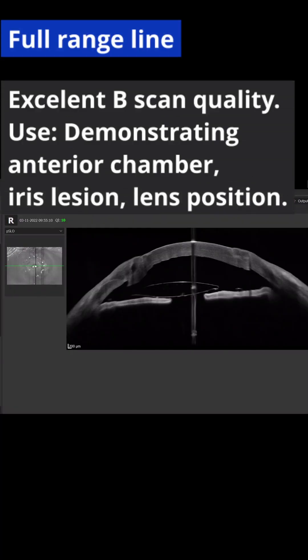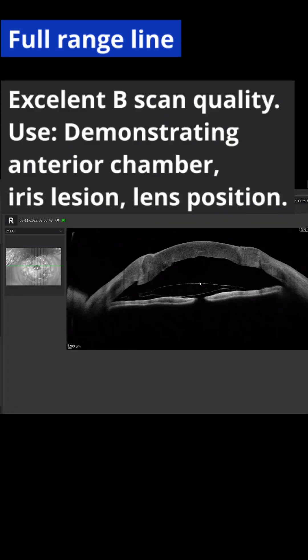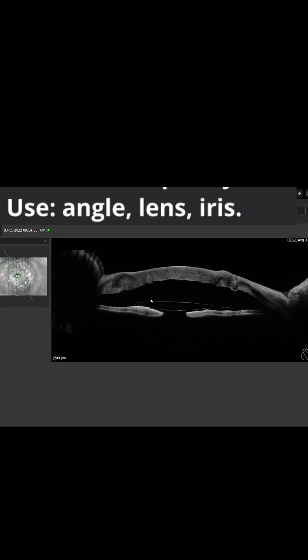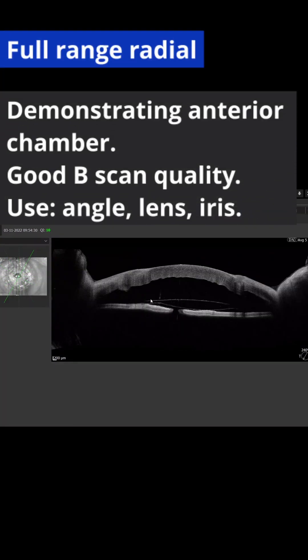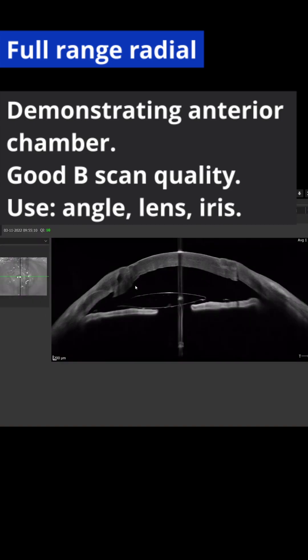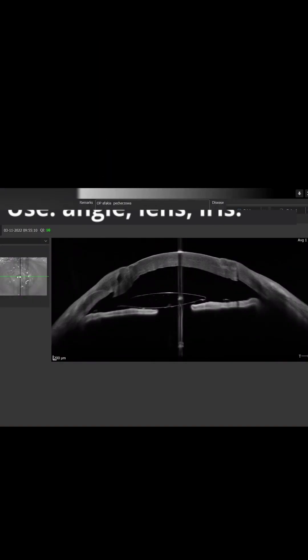Full range line scan offers excellent B-scan quality and is used for iris lesions. There is also a radial full range scan which can be used for the lens and iris, and it is composed of multiple line scans.